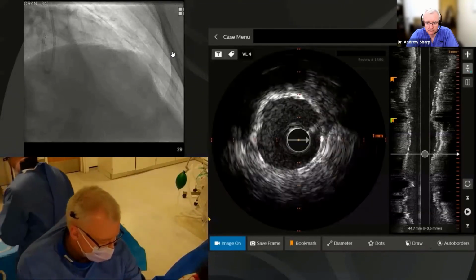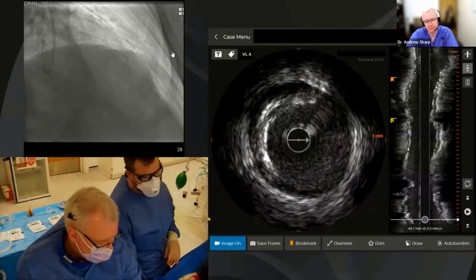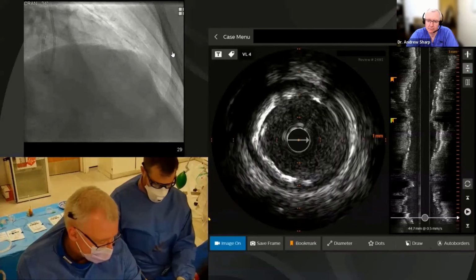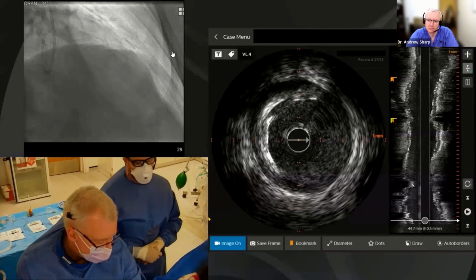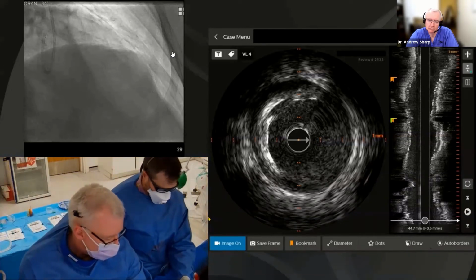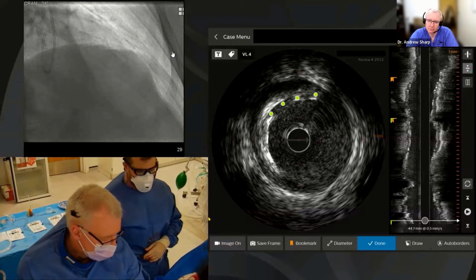And then the stent comes in. We look at the proximal edge, and we're looking for plaque burden here. There's not 50% plaque burden there. If I measured it, I'm sure I'd tell you. And then we're looking for dissections, and there's no dissection there. What we're seeing up at the 10 o'clock is the minor malapposition I talked about. I'll just draw that here. Right here, there's minor malapposition.